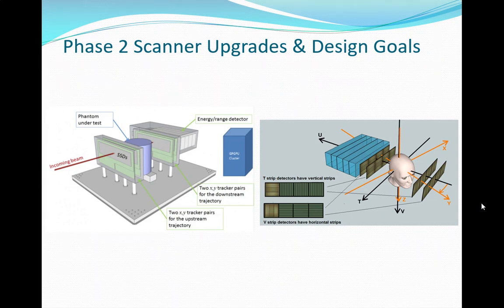So some people are trying to drop the front ones because when you're scanning, you kind of know where it's coming from, and it's really narrow. So why bother even putting the front detectors on? Just do the backside. And as far as we're concerned, that's fine. Just turn it off, right?